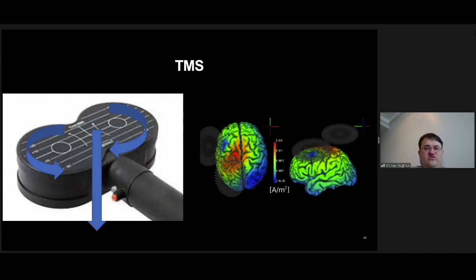Another clinical application, which I'm sure many people here are familiar with, is transcranial magnetic stimulation. It's an FDA-approved treatment, approved in most jurisdictions in the world. We know that it has class 1 data in a number of different diseases, and most importantly, we know that it's extraordinarily safe, at least as far as neurologic treatments go. But the question is, what part of the brain should we be stimulating? Because while it's not entirely focal, it's mostly focal, and an emerging body of data demonstrates that where you target matters. It's not necessarily whether you hit the frontal lobe or not, but specifically what part of the frontal lobe you are hitting. So this raises a question of how do we make sure that we're in the right place for the disease?